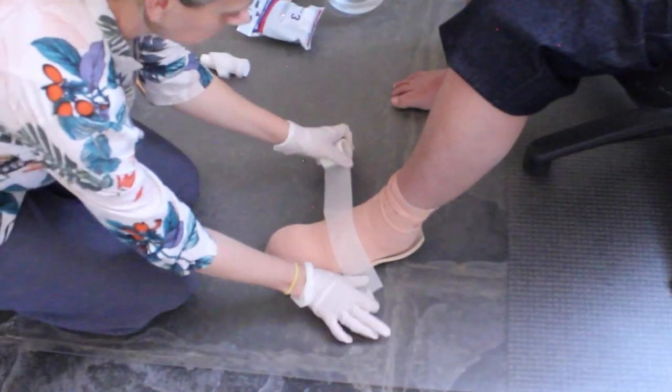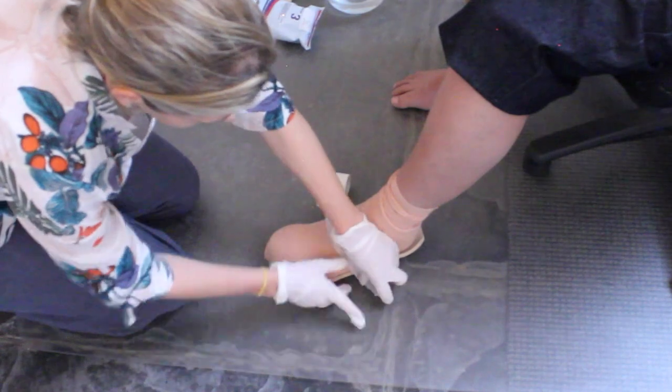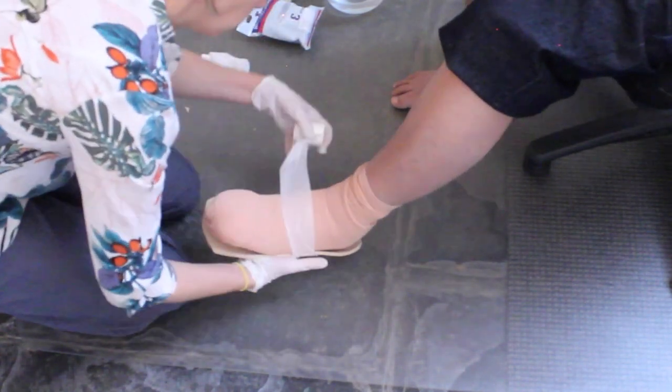Using paper tape, secure the EVA to the bottom of the foot.